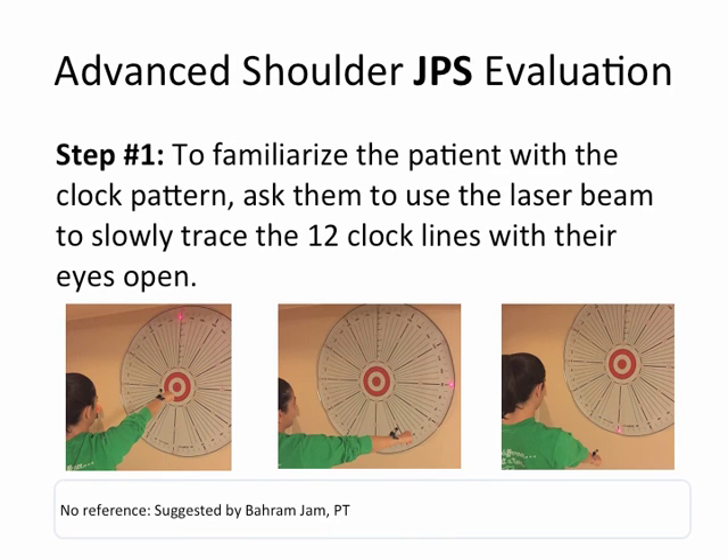Now there's an advanced shoulder JPS evaluation method that is a level higher than the one we just reviewed. Step one: to familiarize the patient with the clock pattern, ask them to use the laser beam to slowly trace the 12 clock lines with their eyes open, as accurately along each line as possible. For example, you say: go to one o'clock, come back to the center. Go to two o'clock, come back slowly to the center.